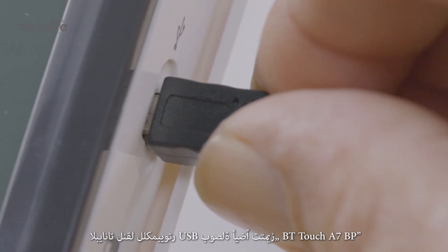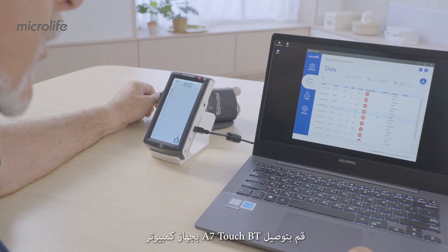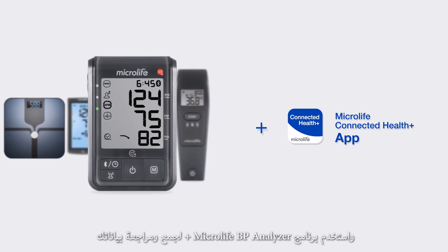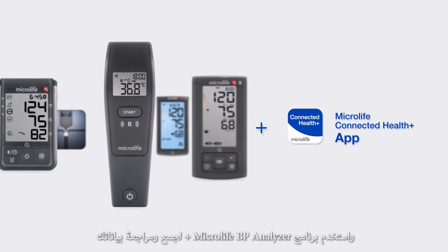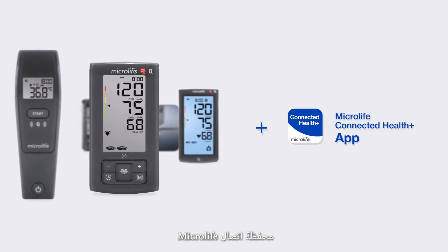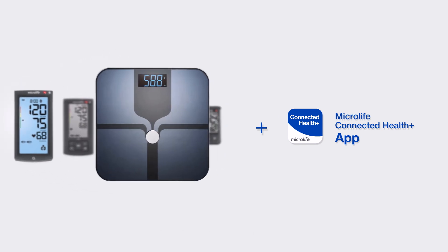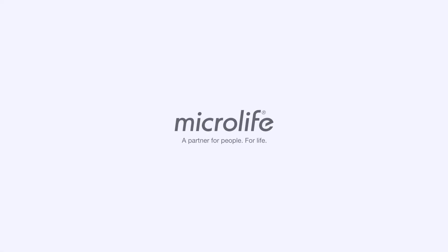The BP-A7TouchBT also features USB PC link for data transfer. Connect the A7TouchBT to a PC and use the Microlife BP Analyzer Plus software to collect and review your data. Microlife's connectivity portfolio helps you keep full track of your health. Microlife — a partner for people, for life.